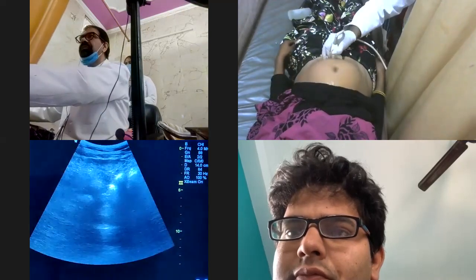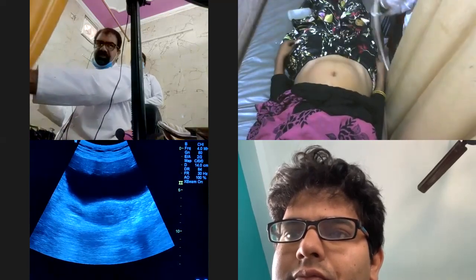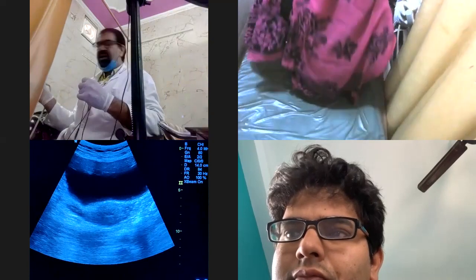Now coming back to the uterus. Now this is the uterus in transverse section. Now see the question which I posed in the start. What was that?